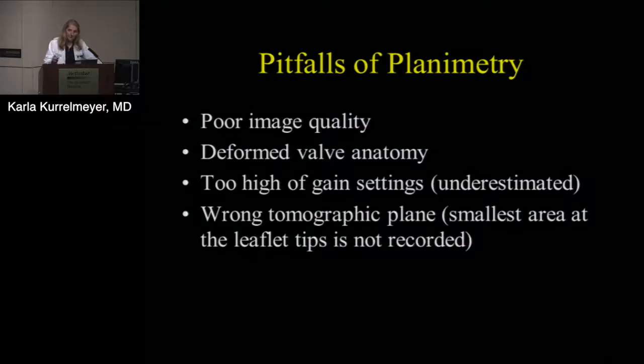Of course, there are a lot of pitfalls to planimetry. Poor image quality is probably number one. Number two is probably too high of gain settings, so there's even more blooming artifact. Number three, sometimes we're in the wrong tomographic plane, so it's a short axis view somewhere between the papillary muscles and the mitral valve level, and you're really not at the tips, so we're not in the right plane to get the tightest, the smallest mitral valve area.